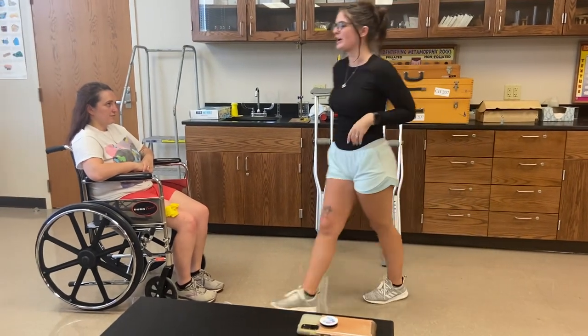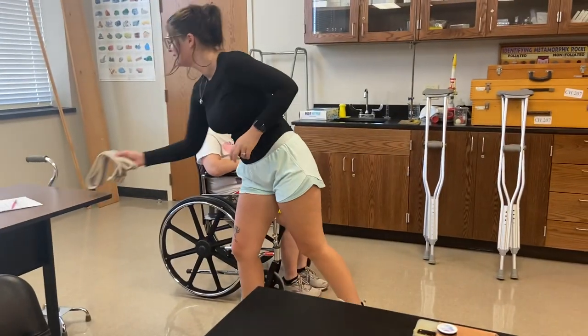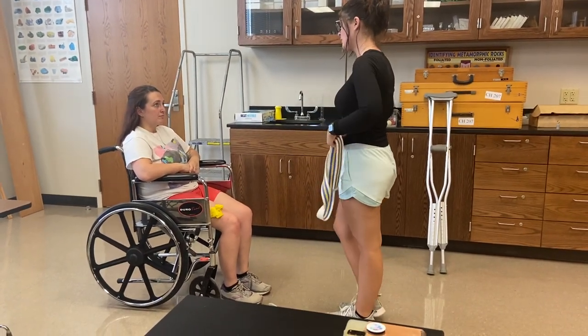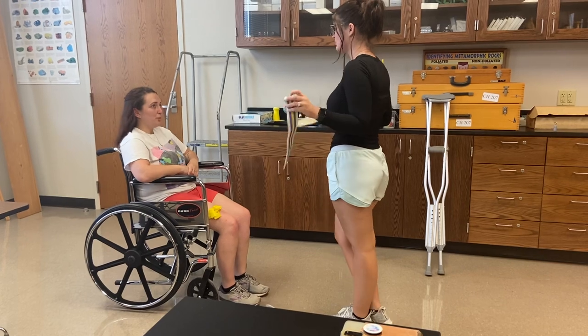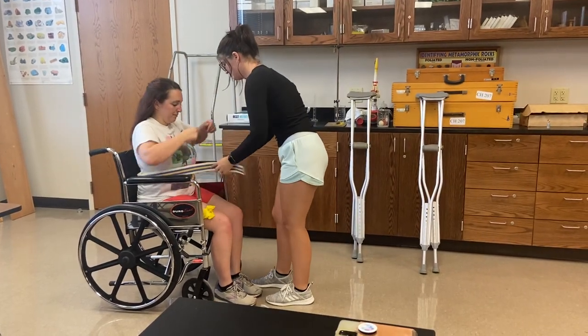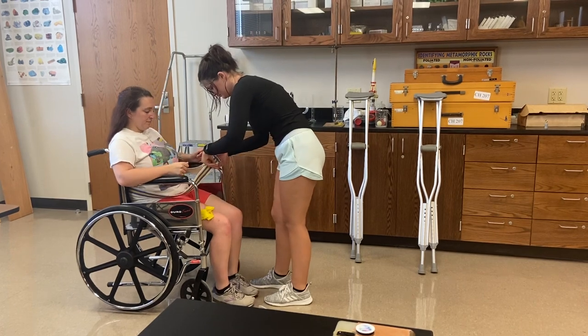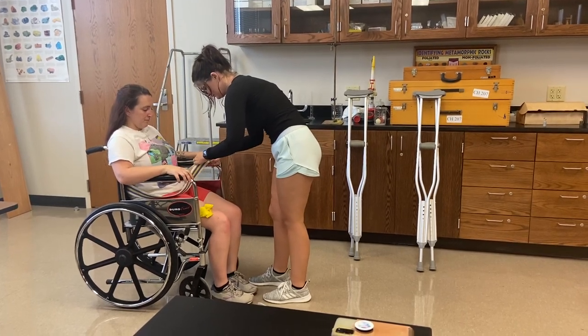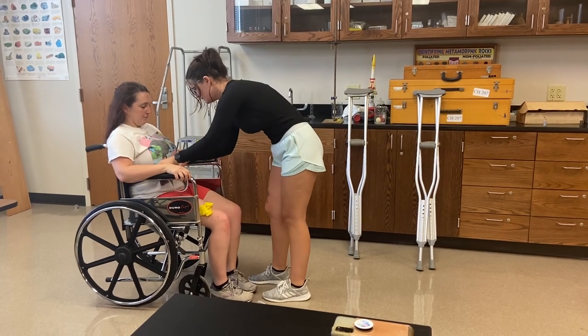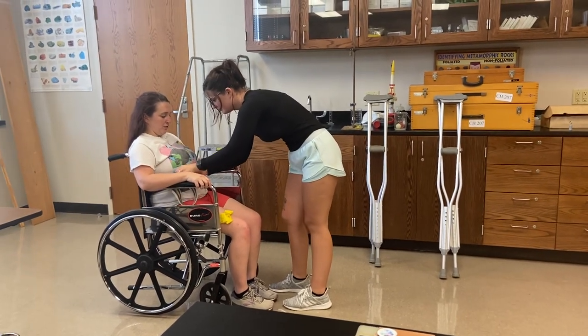So I'm just going to grab the gait belt. Just for safety precautions, do you have any piercings, incisions, anything in your lower abdomen region that you know about? No. That feels good.